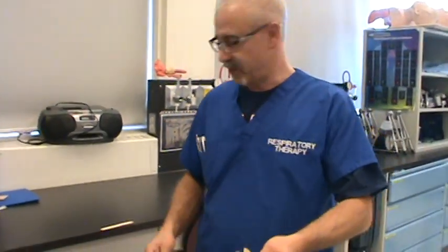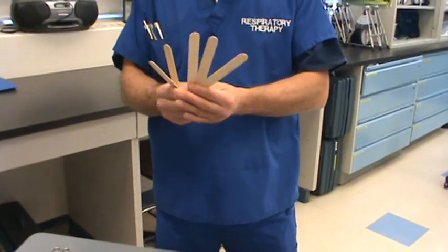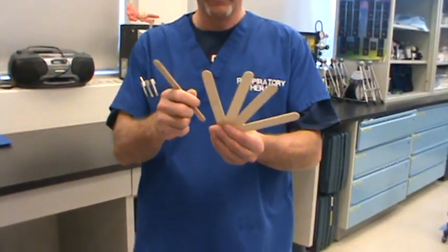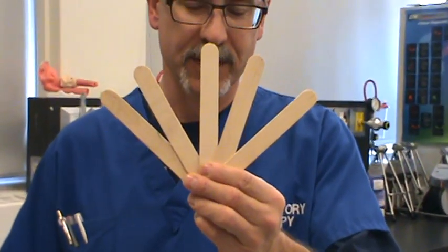And some tongue depressors. A lot of people call them popsicle sticks. I guess you can find them in the larger variety packs that produce the big size Rebels and Fudgsicles. Not that I'm trying to endorse any kind of ice cream product, but they are simple tongue depressors.